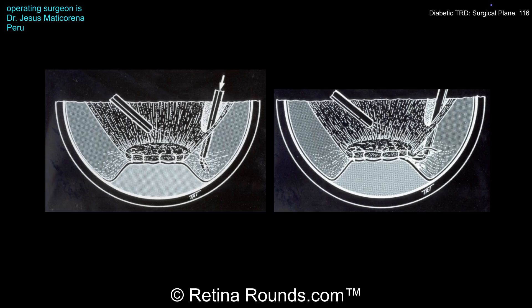Preoperative OCT imaging can be helpful to see where a partial PVD is present. If unsure, intraoperative use of triamcinolone can confirm areas where the posterior hyaloid is up. To access the space between the posterior hyaloid and the retina, a hyaloidotomy can be created with the vitreous cutter. Cutting the vitreous in a circumferential fashion further exposes the correct space and surgical plane.